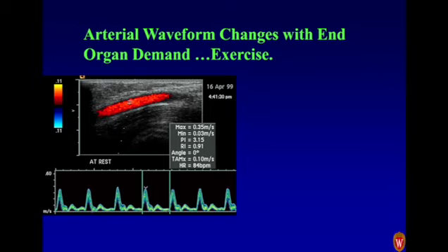So I gave this volunteer a towel. I rolled it up and I put it in their arm and in their hand, and I said, here, pump this up. It's like when you're going to get an IV started, you tell the patient, pump up, make a fist. And you know what you're doing? You're making them work. And so the muscles of that arm now have a higher demand for oxygen.